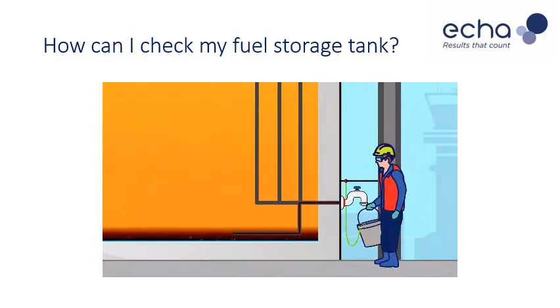So what about fuel storage tanks and filter vessels? Well, again, the best chance of detecting microbial growth will be to take samples from the bottom, usually from drain points. However, because these are drained very frequently in most fuel supply facilities, it may actually be very difficult to recover water. So often, in a routine monitoring program, it will be better to regularly test fuel phase samples from the bottom of the tank to ensure consistency.